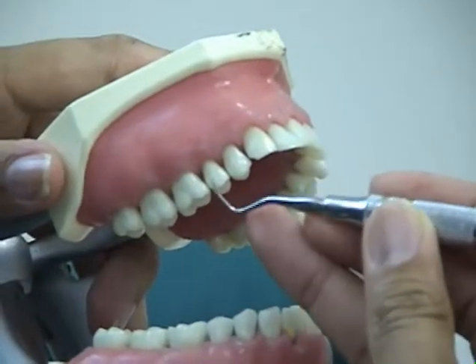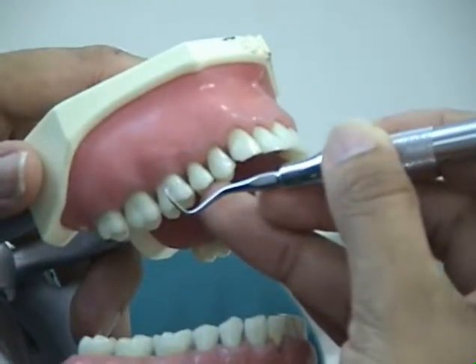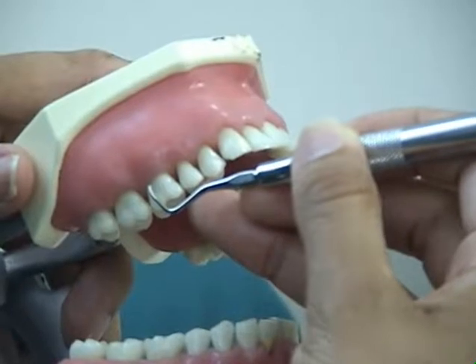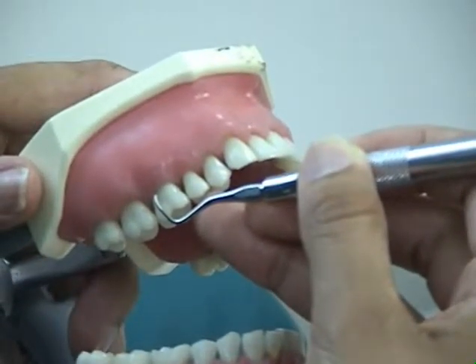To determine which working end is correct, place the curette next to the tooth you wish to scale, with the toe pointed in the mesial direction. Notice the terminal shank is parallel to the long axis of the tooth. This is the correct working end.